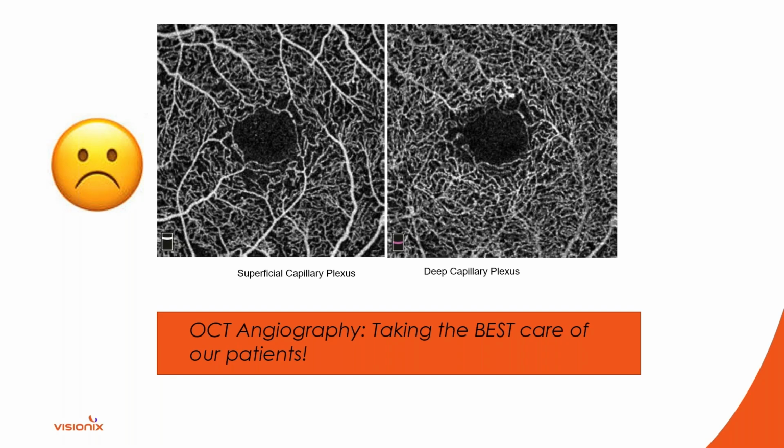I'm sure that a lot of people are thinking, how would this change my management? We can talk about that later on if anyone has questions, but certainly I would see this patient back before a year. And more importantly, the communication with the primary care physician is what needs to change, right? The education to the patient needs to change. Their behaviors need to change.